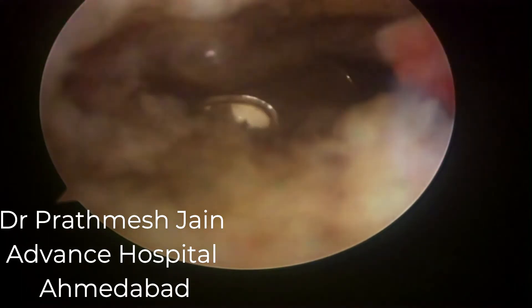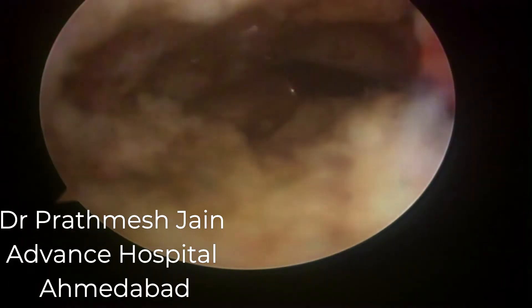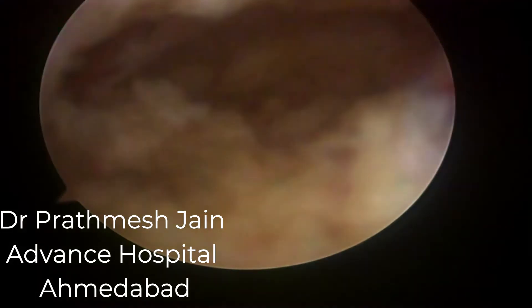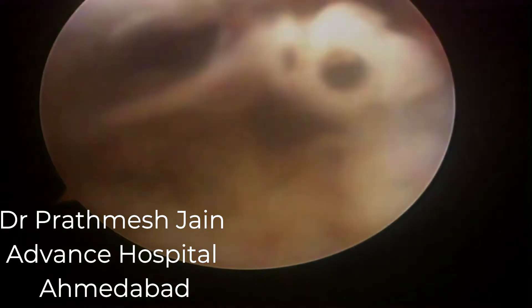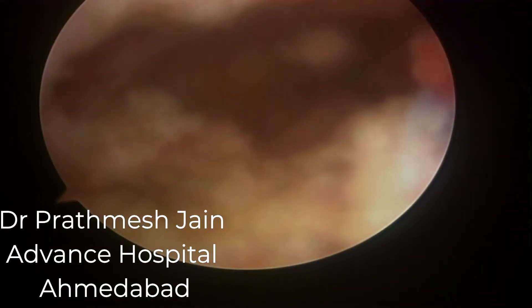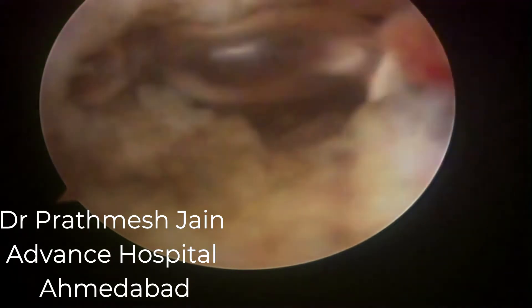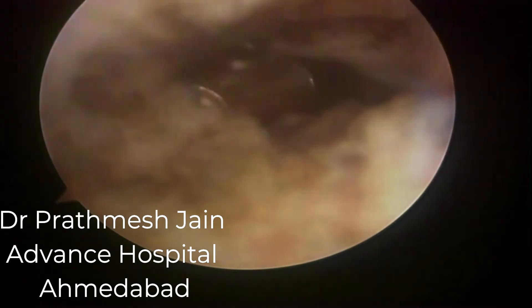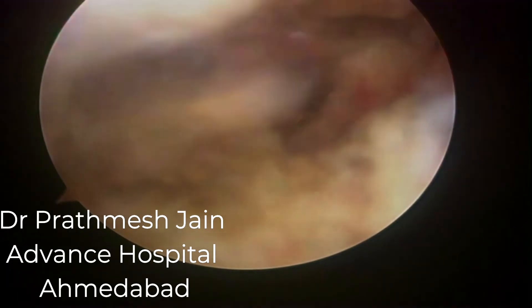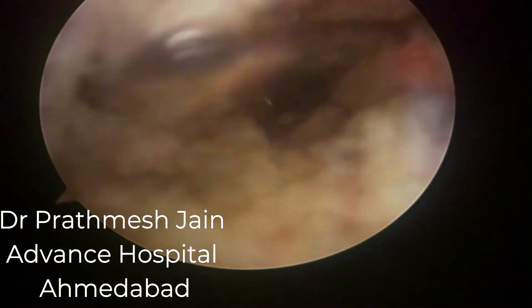To repeat the sequence: intercondylar notch, medial patellar retinaculum, lateral patellar retinaculum, medial gutters, lateral gutters, then the suprapatellar pouch area. In the suprapatellar pouch you may have to go up to one to two inches deep, as there are usually adhesions extending from the quadriceps to the shaft of the femur.